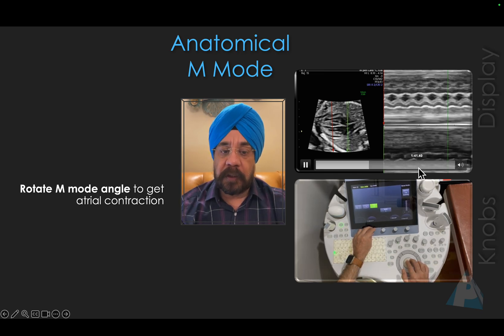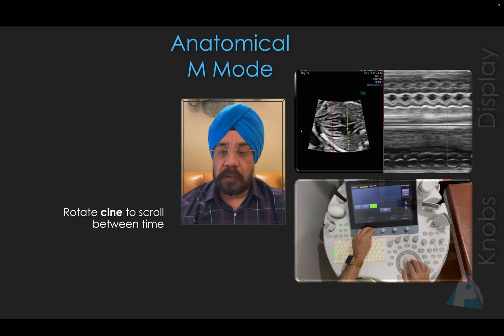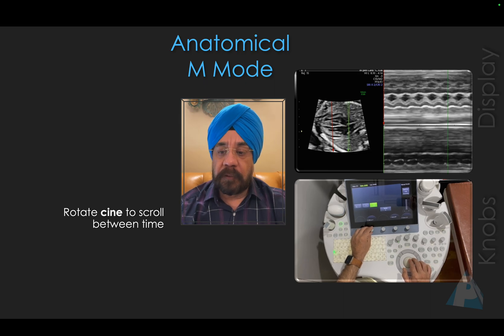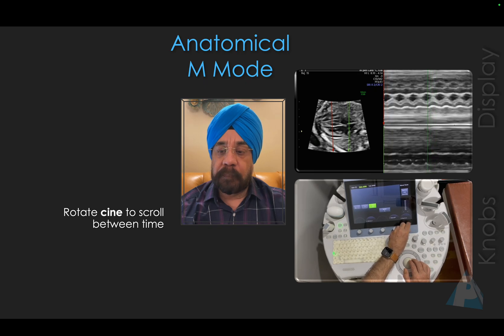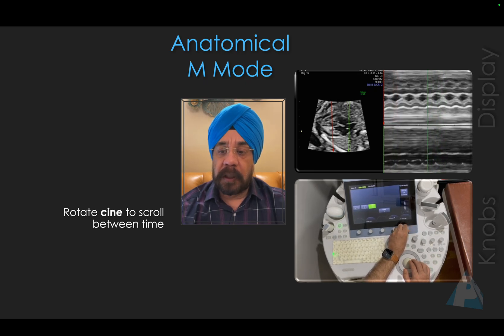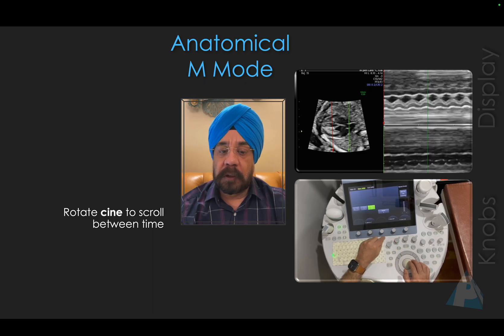Once you have a good atrial contraction, you can scroll the Cine. You rotate the Cine knob to move through the saved frames — you can see the cursor moving as you scroll. You can go to various beats and find a missing beat, an ectopic, or some arrhythmia. This is how you rotate and go through the saved clip.